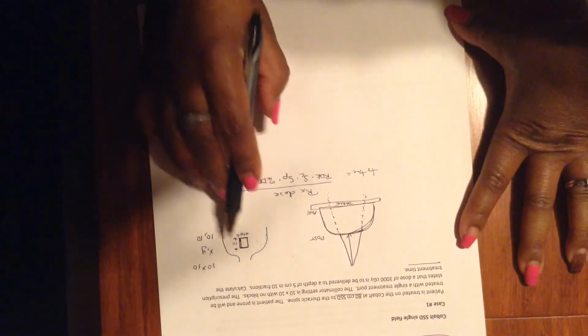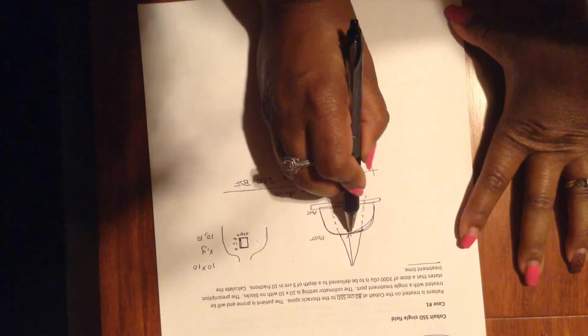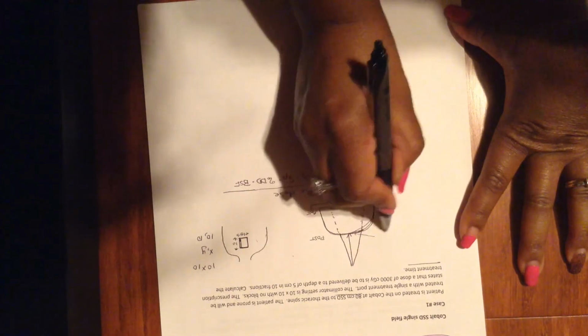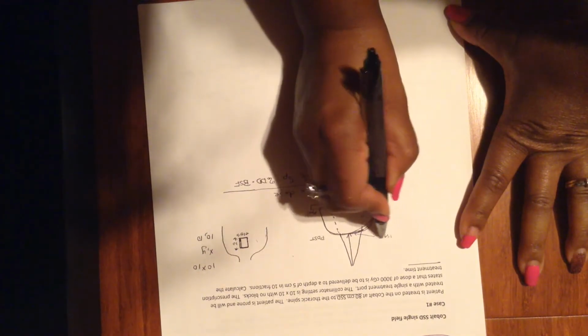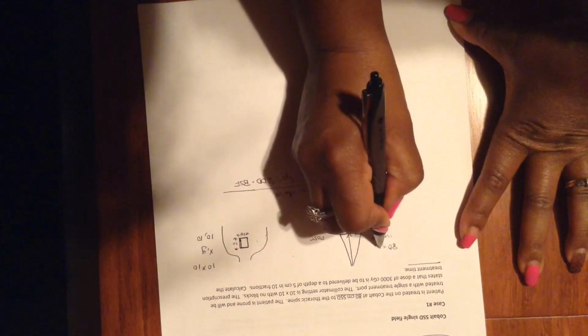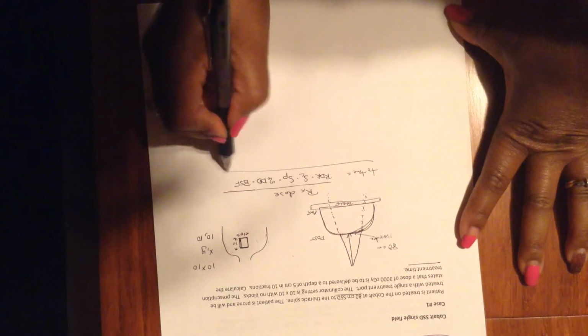There are no blocks. We're treating at a true SSD where isocenter is on the patient's skin, so we don't need the inverse square correction. Isocenter is here. SSD is 80 cm. So this would be the formula we need for this one.